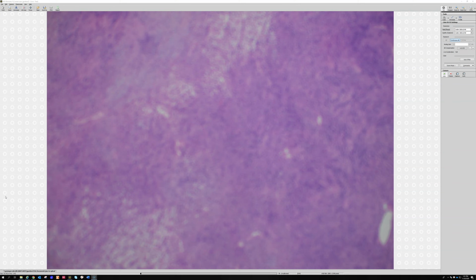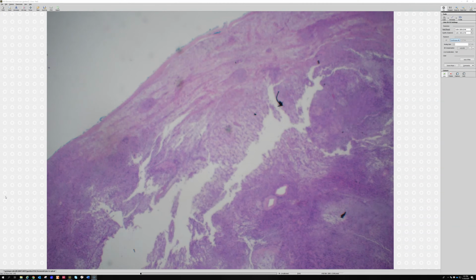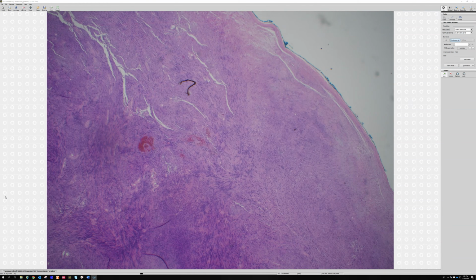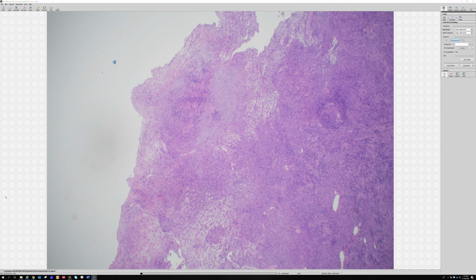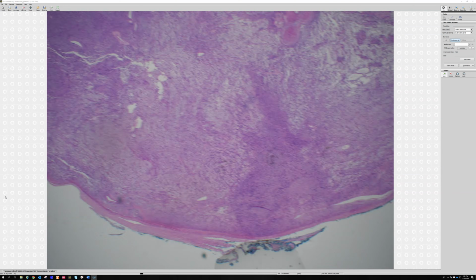Okay, so number 5 is a 20-year-old female with a 2-centimeter neck mass. Schwannoma, good. A very nice one. You're right, this is a great example, trying to get the slide clean here, of schwannoma.